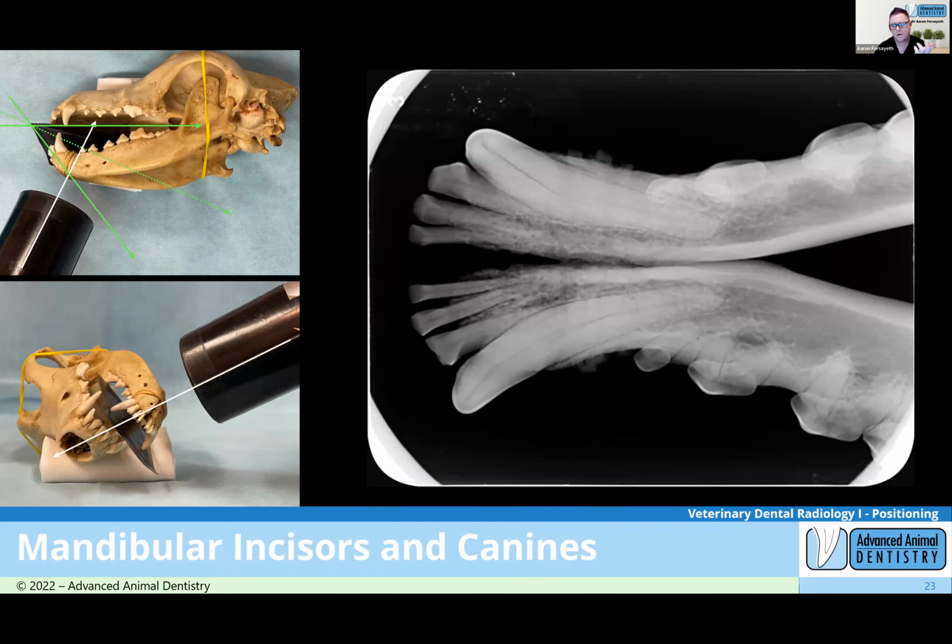Which is important to remember, because our dental X-ray machines don't actually generate a lot of radiation. So if you're pulling back too far, you're really going to have to compensate by increasing your time, and more time, particularly if it's handheld, you get the shakes and you'll get blurry images as well. Yeah. So you stay right on top of it, basically. I think the guideline generally is just keep the collimator basically on it. Your collimator is a little bit smaller than the size 4, so that's why I pull back that 5 centimeters or so.